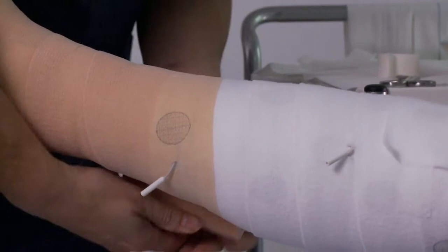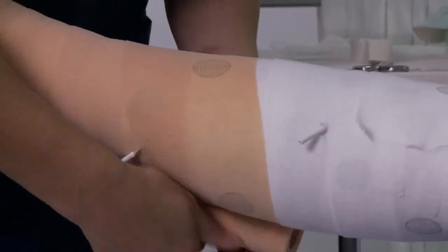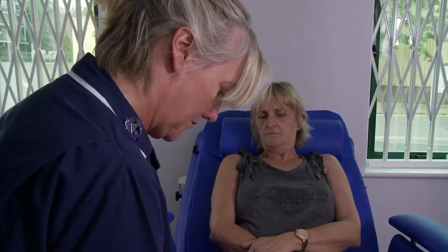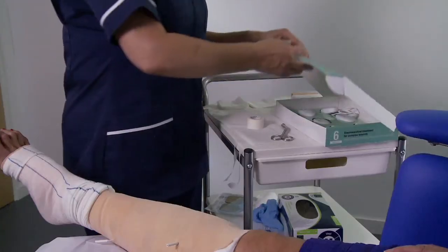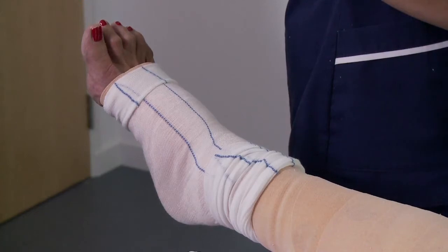Follow the manufacturer's guidance for applying compression, ensuring that the electrode wires are fed through the compression bandage. Once you have completed the compression, you're ready to connect the Axel Heal device to the electrode pads. At this point, put the blue or yellow line tubular bandage over the patient's foot.